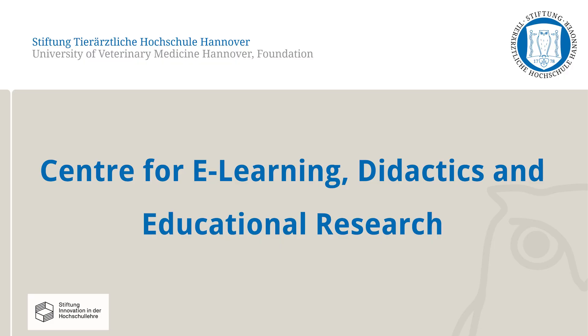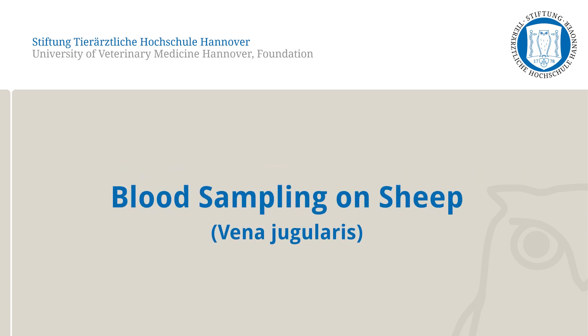In this video, the Centre for E-Learning Didactics and Educational Research at the University of Veterinary Medicine, Hanover will demonstrate how to take a blood sample from sheep from the vena jugularis. Only one of the correct methods to perform this skill will be shown here.